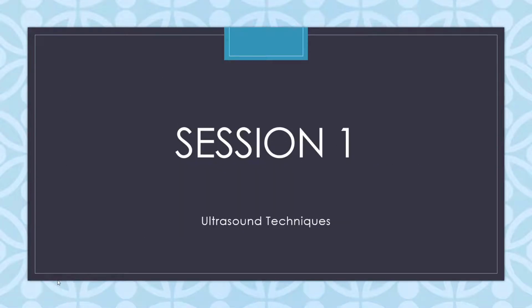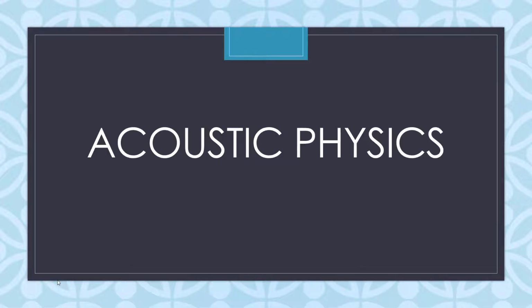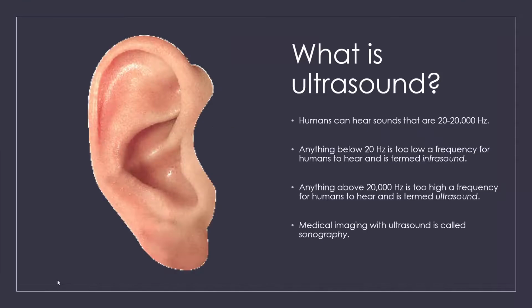Okay, first we're going to start talking in session 1 about the ultrasound techniques. And we can't talk about ultrasound without learning just a little bit about acoustic physics. Now, we're not going to go in depth like if you were in sonography school on physics of ultrasound, but you do need to know a little bit.